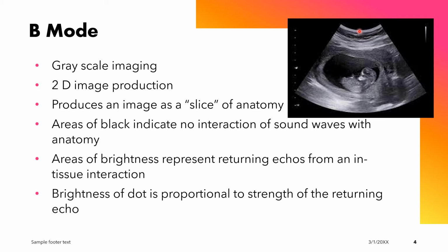If we looked at this longitudinal image, then what was towards the curve of our curvilinear transducer here would be the anterior aspect of the patient, or the surface of their abdomen. What is posterior here would be towards their spine. Now, if this was in longitudinal orientation, what's to the left of the image is towards the patient's head, and what's to the right of the image is towards their feet.